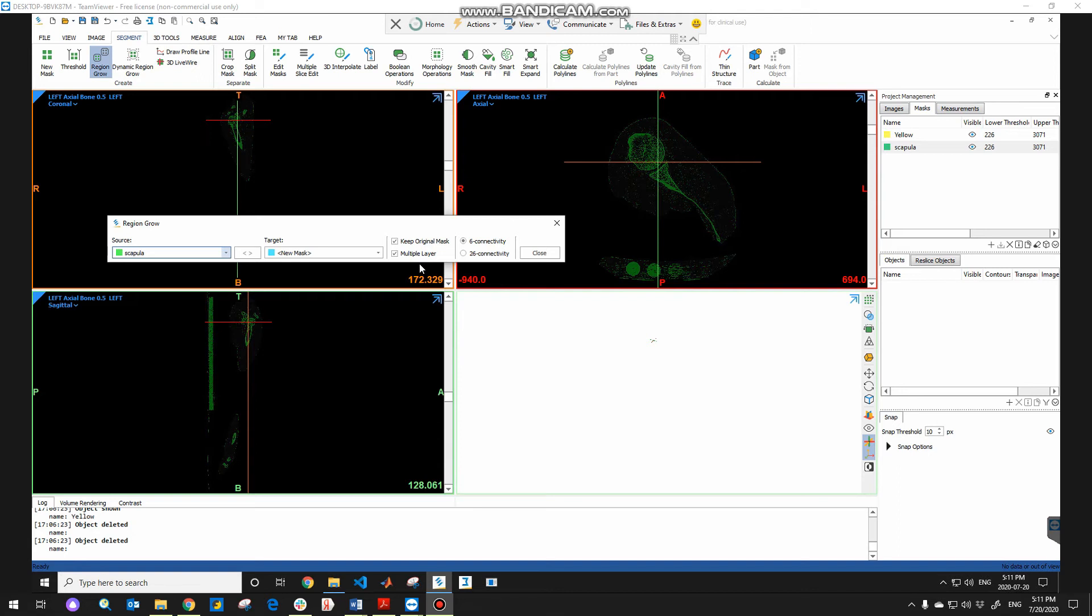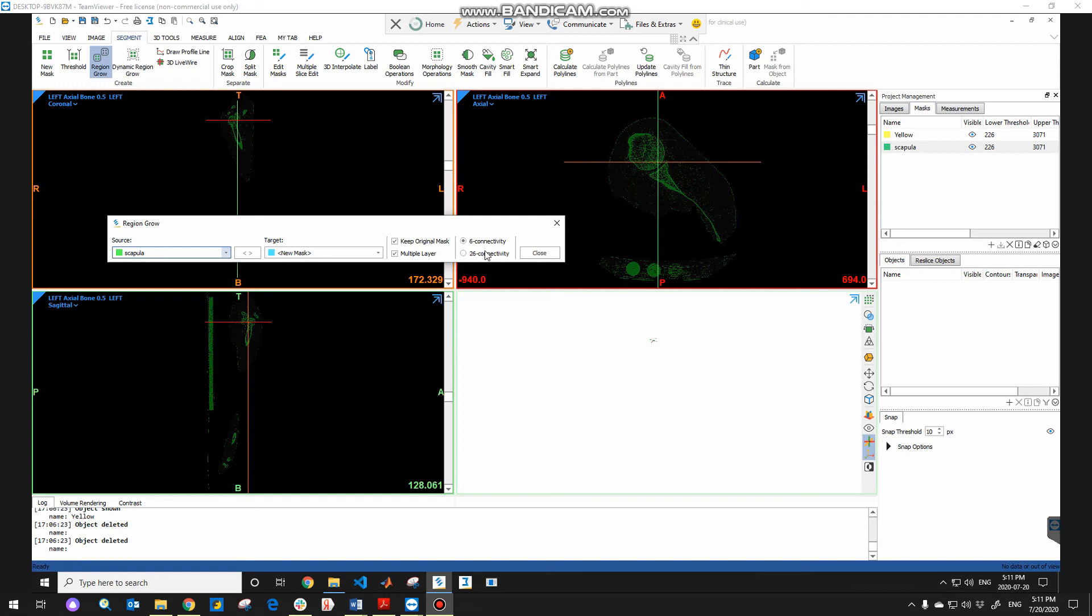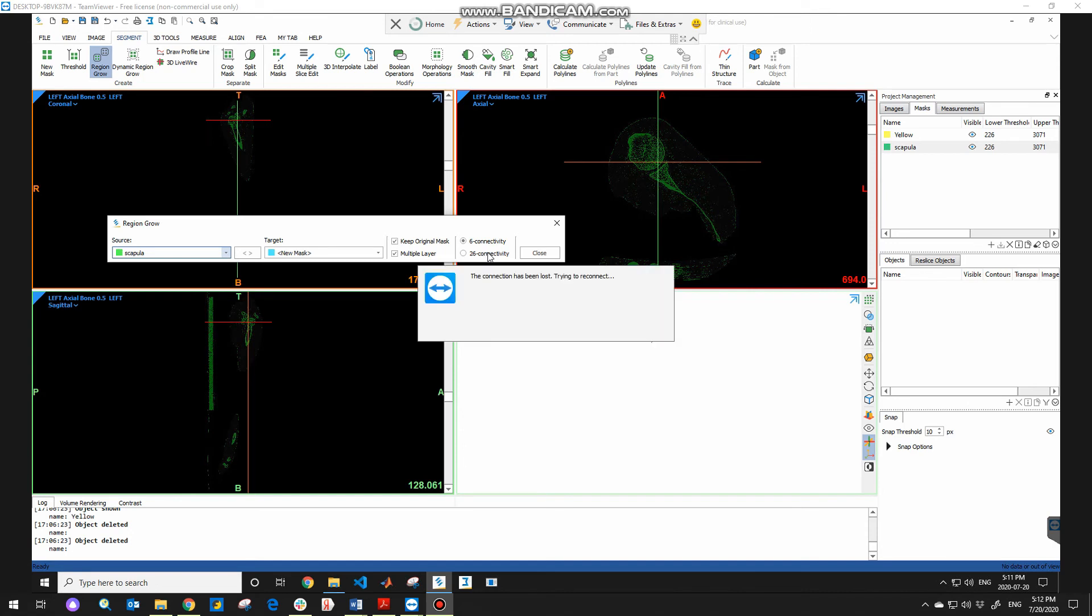Usually for models that the parts are fairly far from each other, I mean not to stick with one another, you can use either 6 or 26 connectivity. But for more complicated models, I would suggest to choose 6 connectivity so that the region growing will happen more precise and smooth. So basically, 6 connectivity means that every node will connect to its neighbor nodes in 6 directions to spread all the pixels. So I'm gonna choose 6 connectivity.